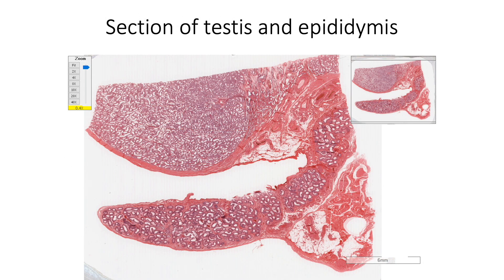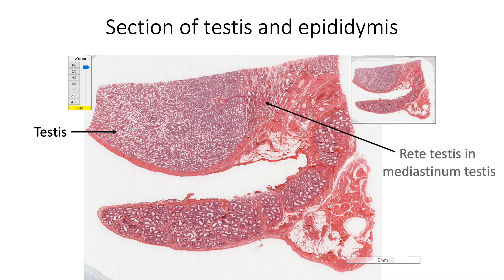The testes are a pair of gonads suspended in the scrotum by the spermatic cord. They are the primary sites for production of spermatozoa and also act as endocrine glands because they secrete testosterone. Here we are also seeing a section of rete testis in the mediastinum as well as a section of epididymis.